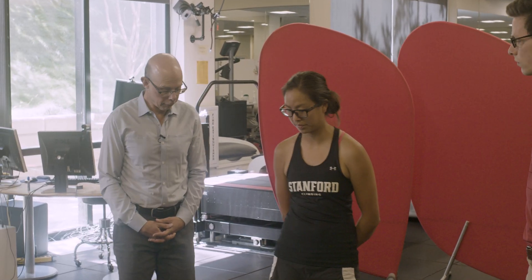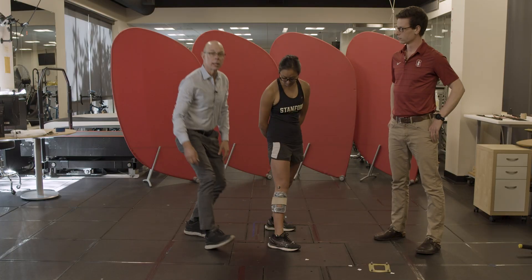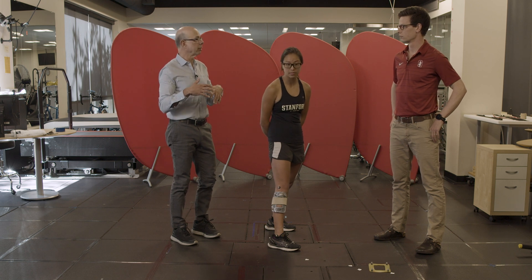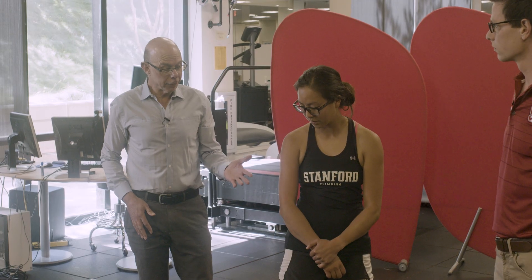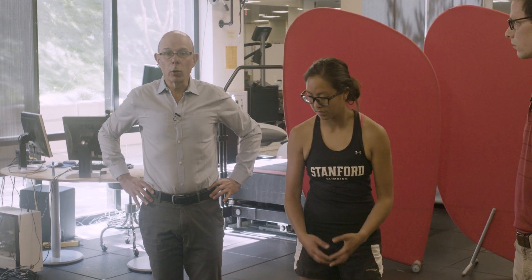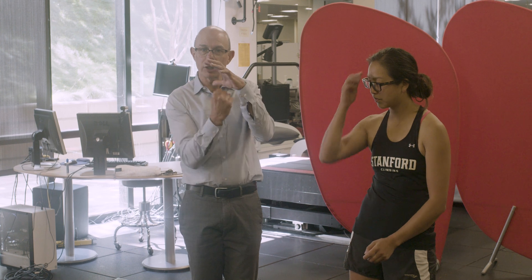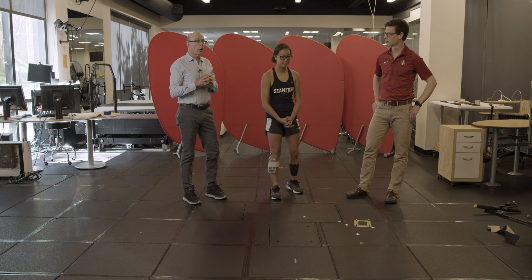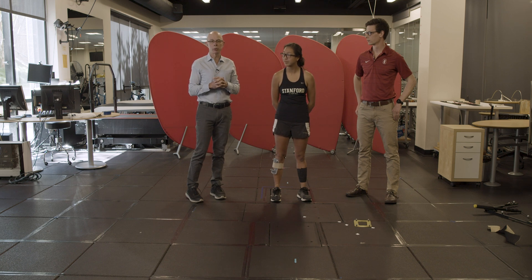Knowing these joint centers is quite helpful. From the ankle markers we get the ankle center, from the knee markers roughly the knee center, and from the functional trial the hip joint center — so we know how the limb is aligned. We also need markers on the pelvis to get the orientation of the pelvic reference frame and the femoral reference frame; it's that rotation of the femur relative to the pelvis that gives us the hip joint center. Now that we have the markers established, we can move on to the next stage of the motion capture experiment.